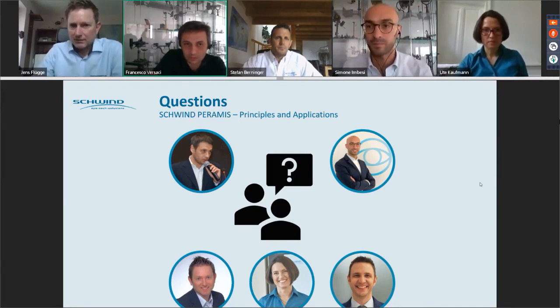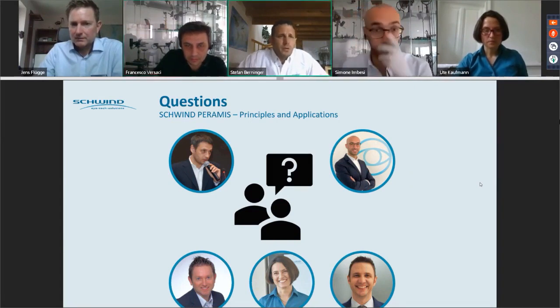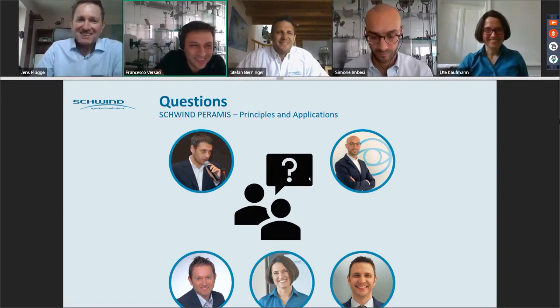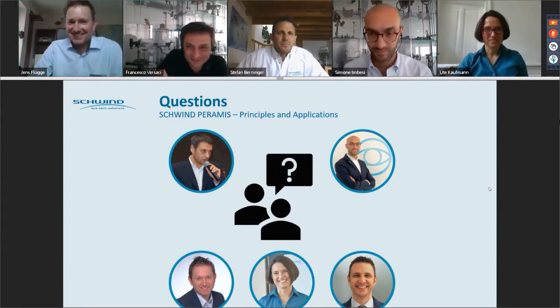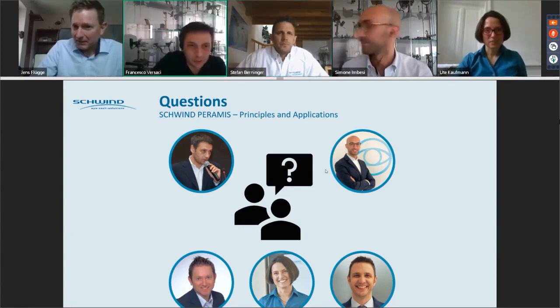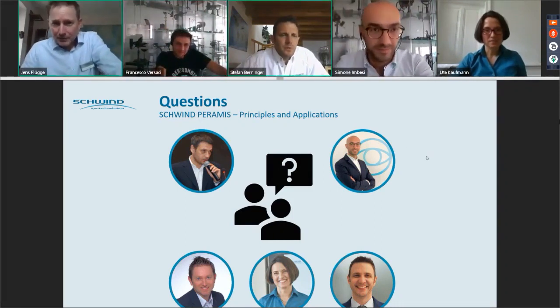Any other question from the audience? There's a question about minimum pupil diameter for total wavefront guided treatment. This is something that probably I know, but you might answer. As far, yeah, correct. Okay, I think that it's time for Simone to speak now. Last question, I think. Yeah, let's make it the last question so that we are right in time.